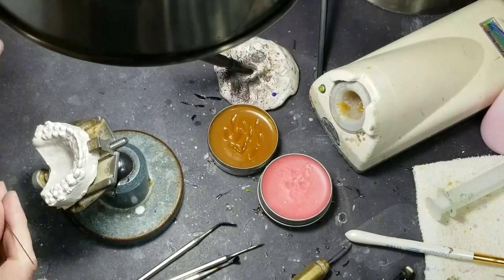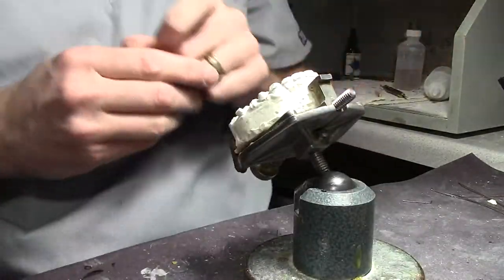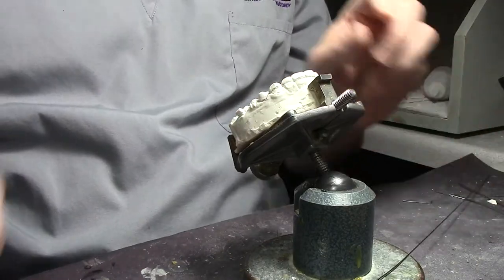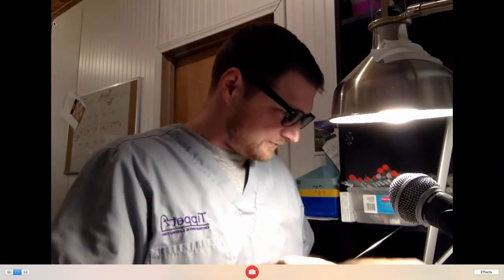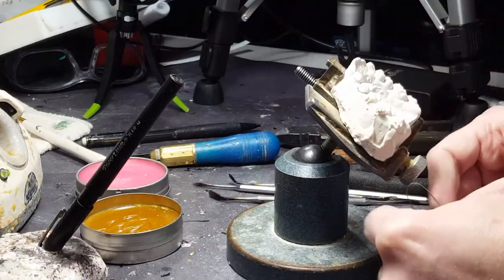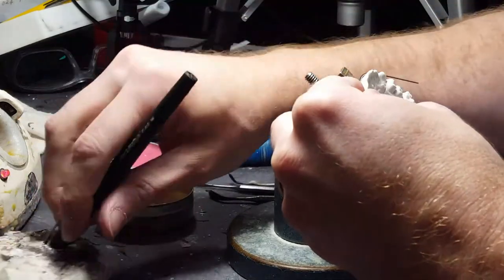All right, what I'm going to use is 030 wire — I like to use that on this. Let me grab some from behind this camera. And you're just going to bend a regular holly. Let me put my glasses on. These aren't prescription, they're just slightly magnified. Magnified — thank you, son, for correcting.